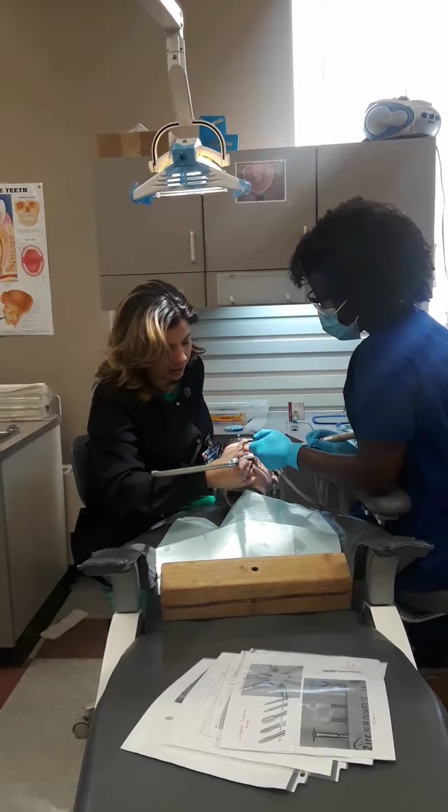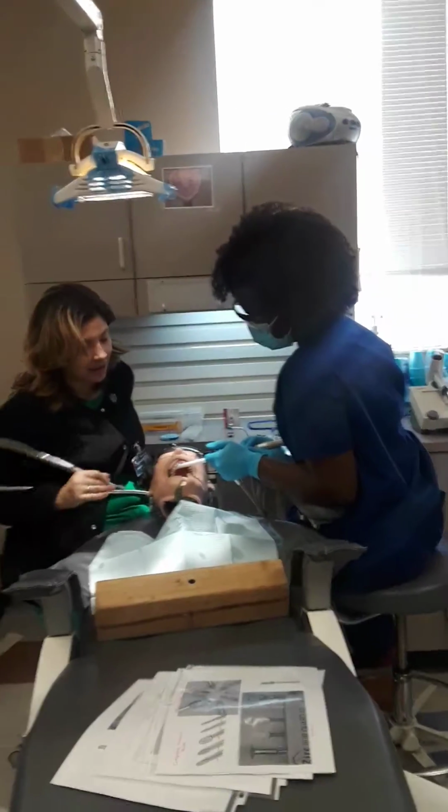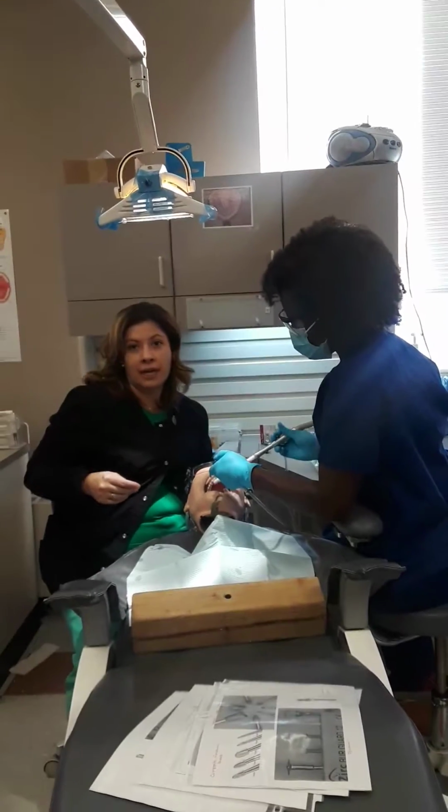So this air. Okay. All right, go ahead and rinse. Then dry, because I just created debris.